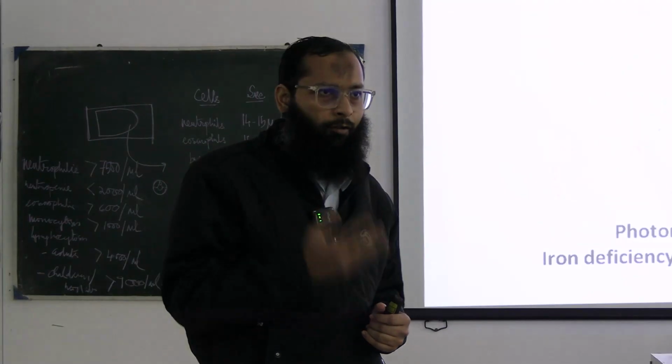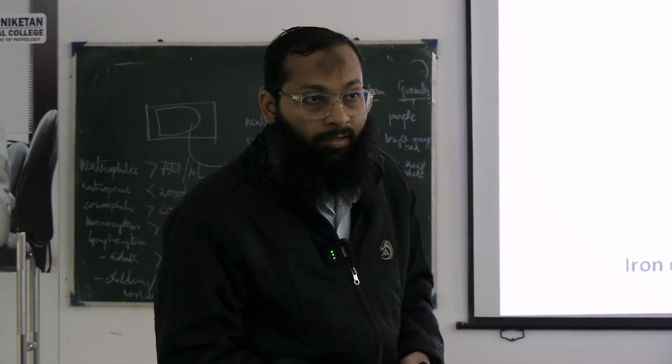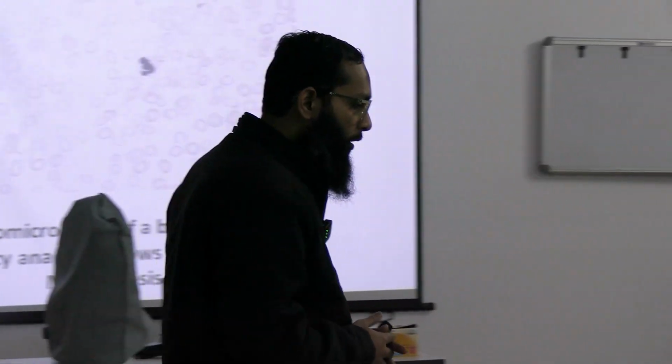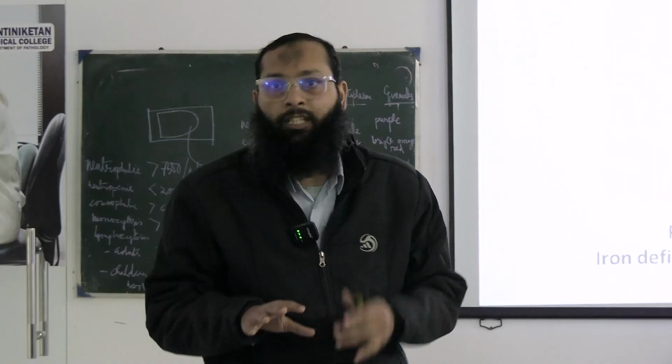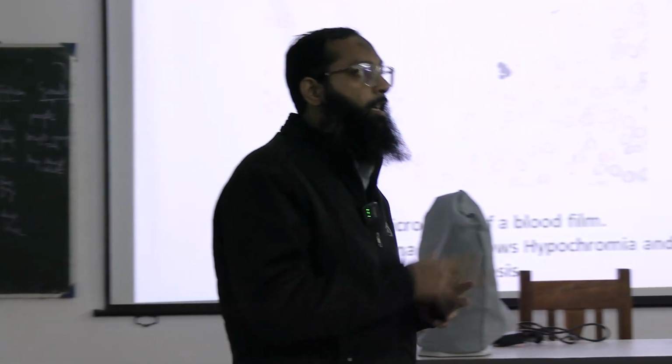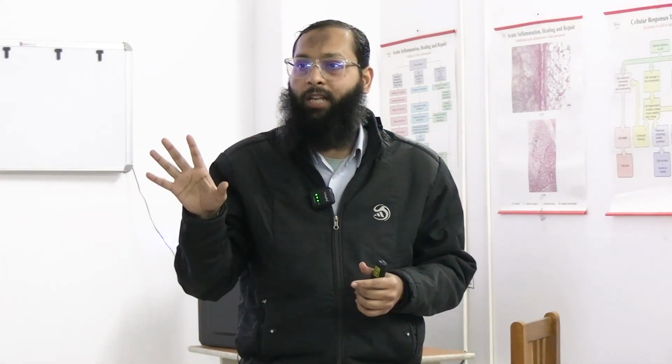Normal RBC. In a patient having microcytic anemia, all the RBCs will be of a smaller size. So, how will you compare with other cells? Which cell? You don't know. Can you tell me? No. Wrong. Any other cell? Don't know. Anyone? How is an RBC compared, whether it's large in size or small in size? It is compared with the nucleus of a small lymphocyte.